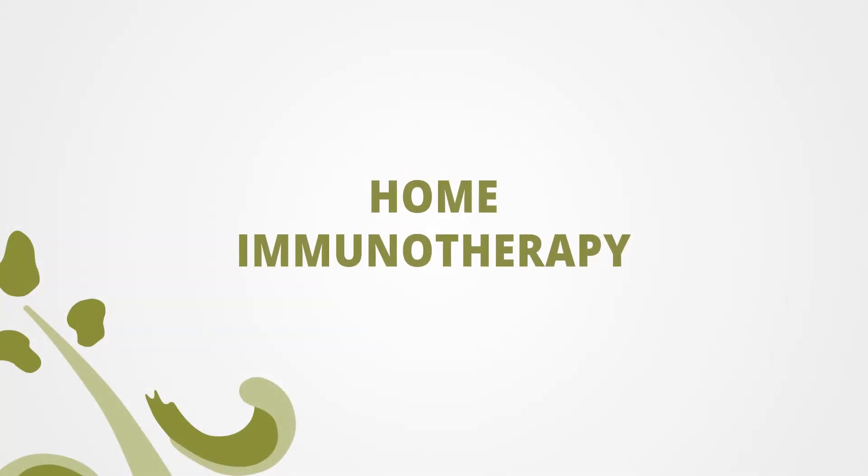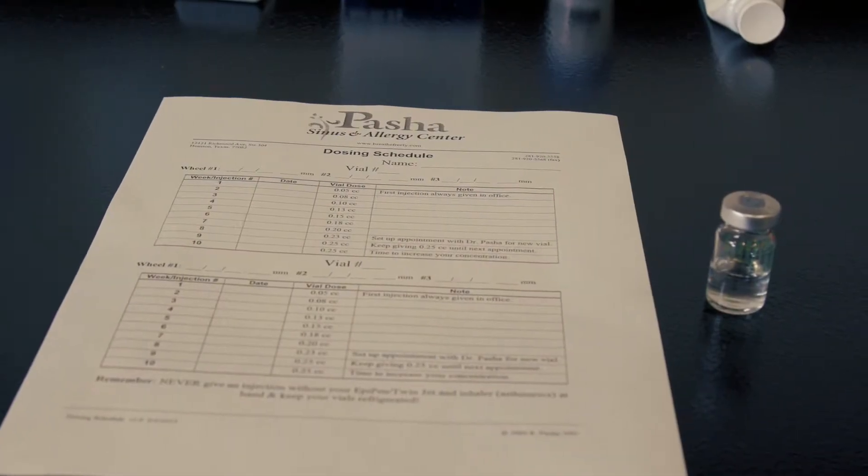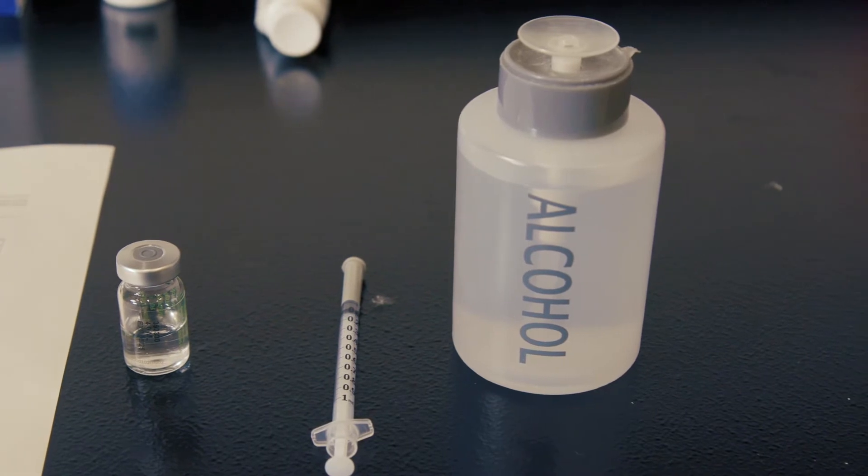Before doing any allergy shots, you are going to want to get your materials ready. You will need your dosing schedule, your allergy vial or vials, allergy syringes, as well as alcohol.